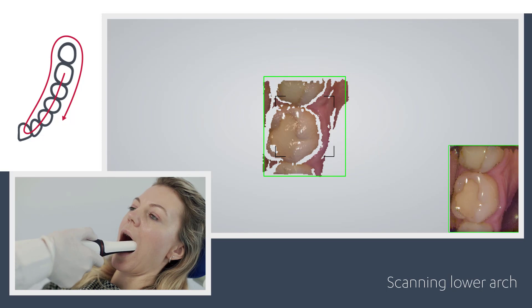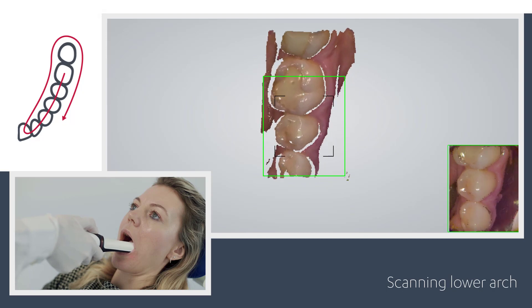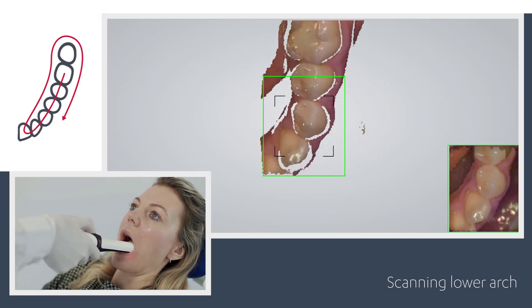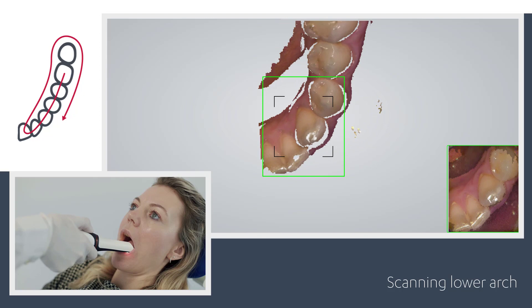The best scanning method is to start with the molar occlusal surface, since it has greater detail for easier identification. Wait three to five clicks, then move towards the canine while the scanner captures the occlusal surface. Move your scanner smoothly without jumping around.